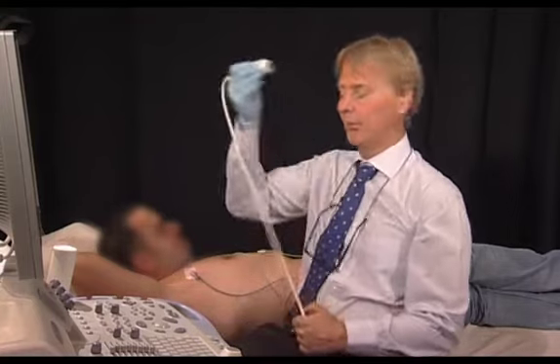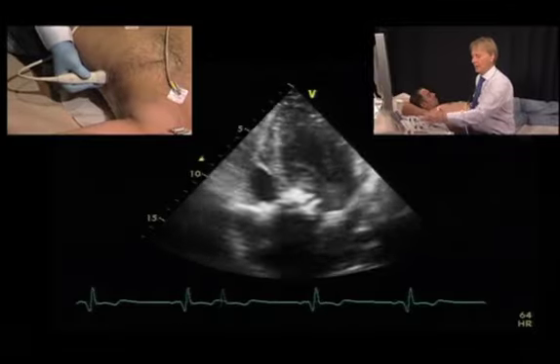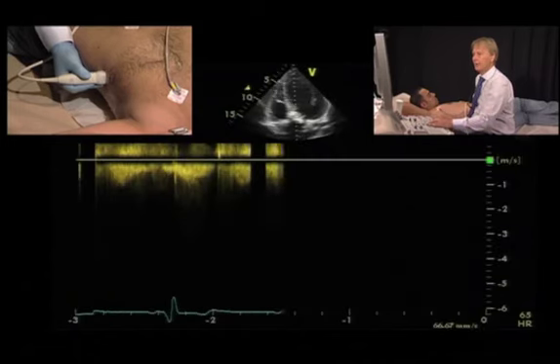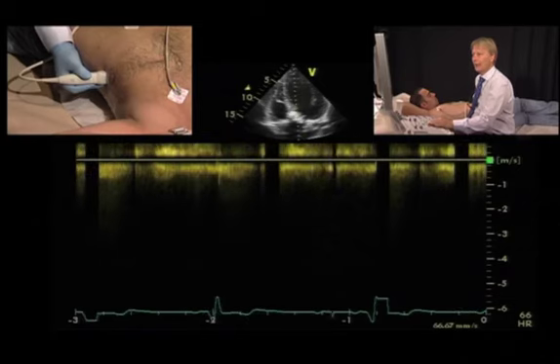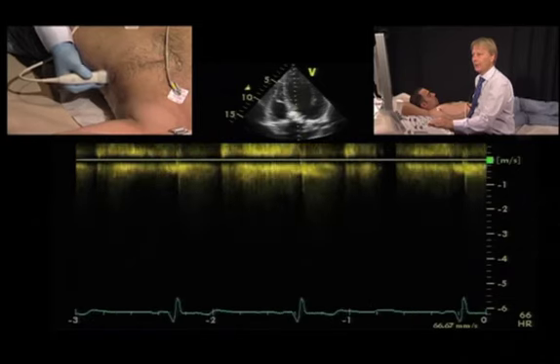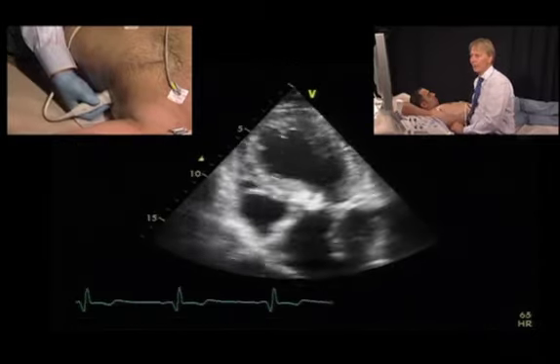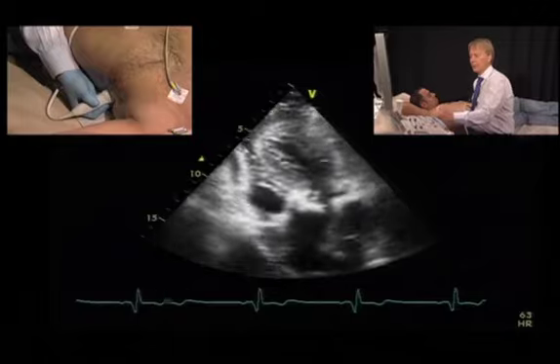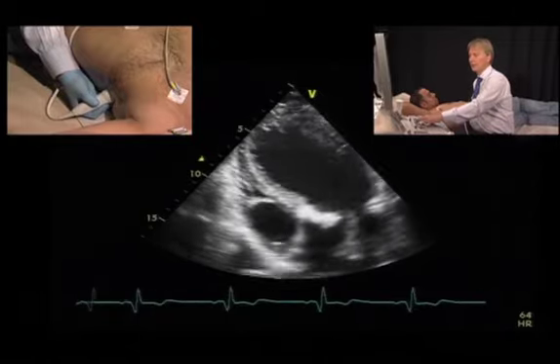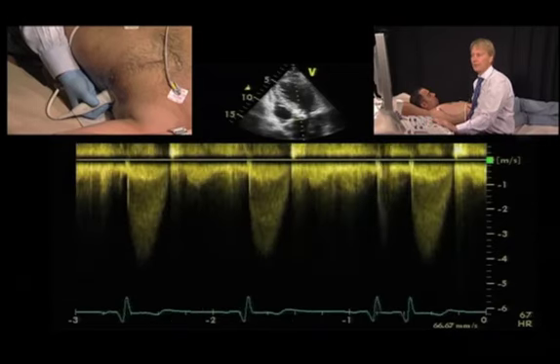To quantify aortic stenosis with CW Doppler, I would start from the apical approach, and I would try to get an apical 5-chamber view and place the continuous wave Doppler spectrum right inside the valve. Now, it's very important to also put the focus point exactly where the valve is. Now you can see the spectrum here is not very good, so you can optimize the signal by moving your transducer further lateral, and then you have a much better angle to the ultrasound beam and you are really parallel. And this way you will usually get much higher gradients than if you use the classical 5-chamber view. And in this case you also get a much better spectrum.